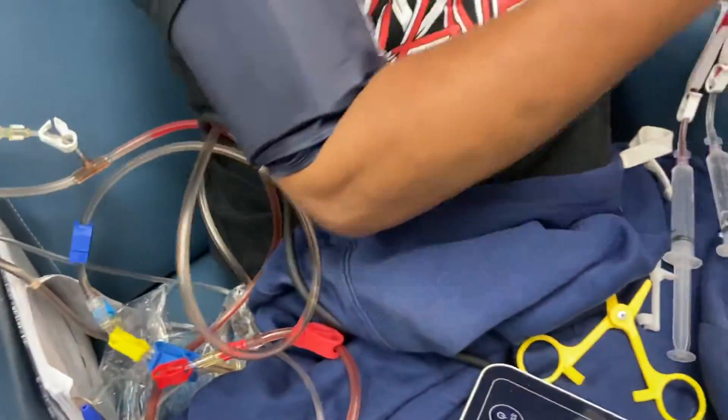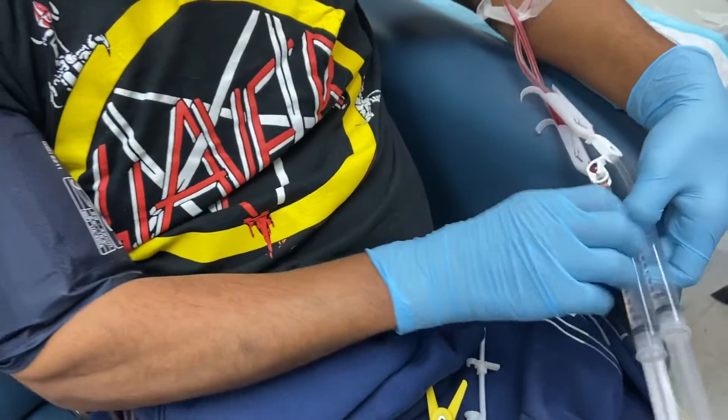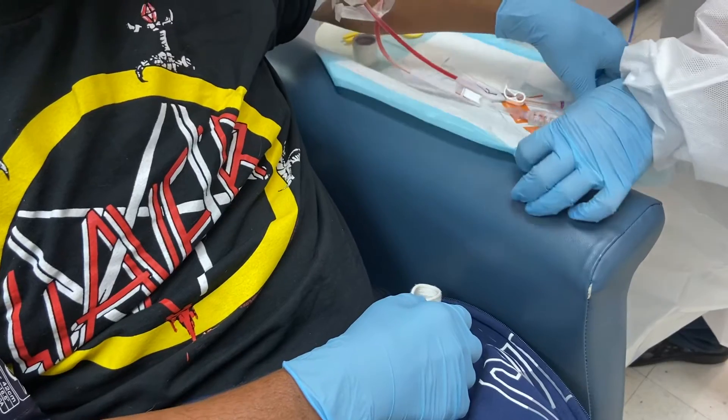So that's how you return your blood by closed system or emergency rinse back.